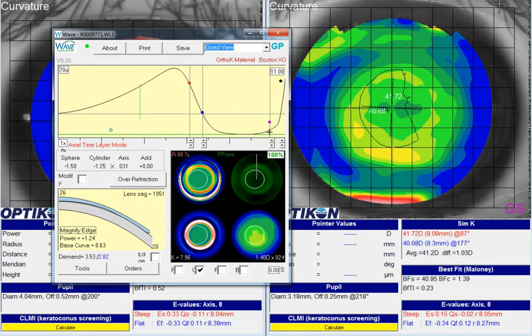If the lens is touching down first at the very edge, then it will pop up the applanation of the lens onto the cornea behind the reverse curve, and that prevents seal off as well. So lifting the edge just helps to make sure this is where we hit first on the cornea, and I did that in 100% mode all the way around.